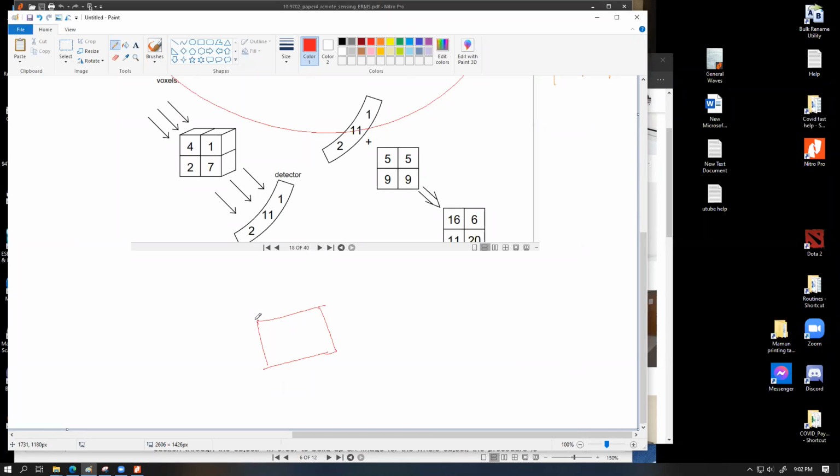So this is the face view, and inside the body we have, let's say, this cuboid section that we are trying to scan. It is not very properly drawn, but try to understand. So let's say this is the section of the body that we are trying to scan. Isometric view, but a very weird isometric view.